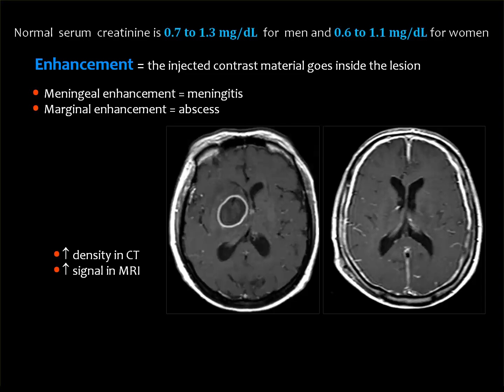provided that you inject the patient with non-ionic contrast material and you instruct the patient to drink a lot of fluids after the examination. You should know that for the patient to have an appointment for the examination, it takes some time and some effort. Then after this time and effort, the patient came, and you say, oh, creatinine level is 1.2. No, I cannot perform the examination.